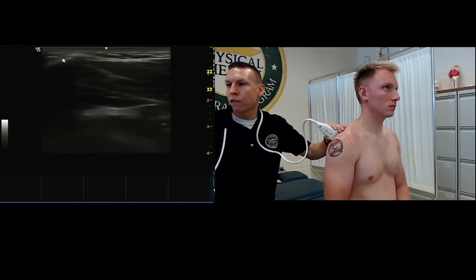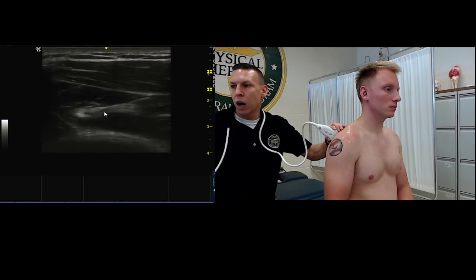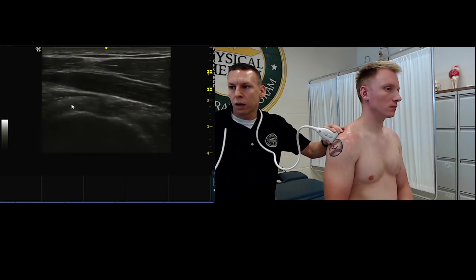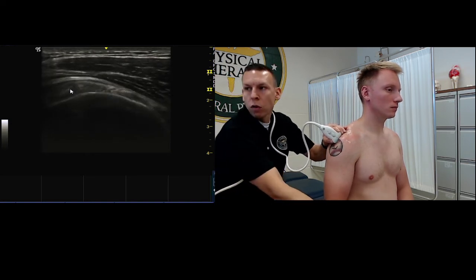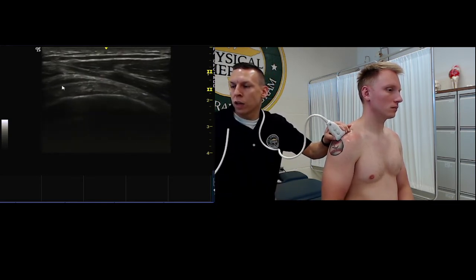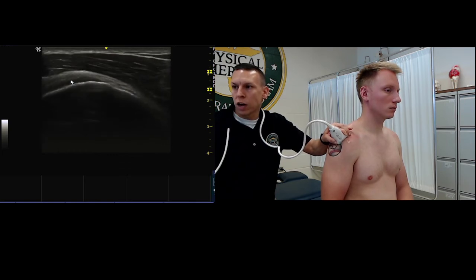If you can identify that bony acoustic landmark, then underneath that we know this is infraspinatus, and this is this aponeurosis. It's a very bright hyperechoic collection of connective tissue. And we can just take that and follow it all the way in short axis. We can even rotate the probe in different directions so we can observe the infraspinatus in short axis here, and look at it all the way to its distal attachment.